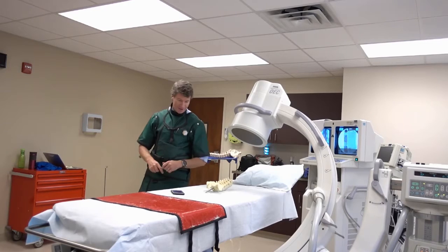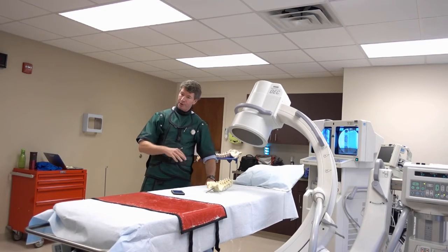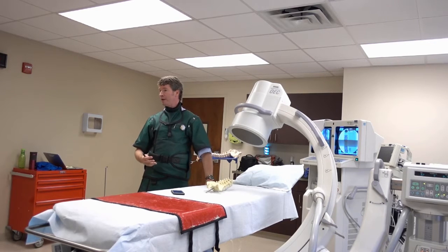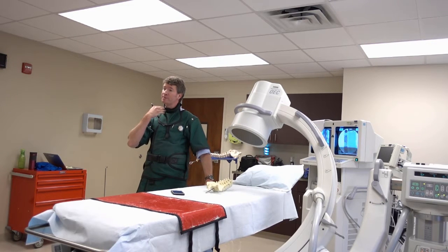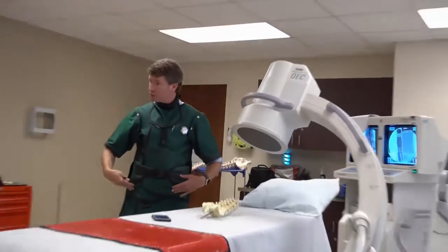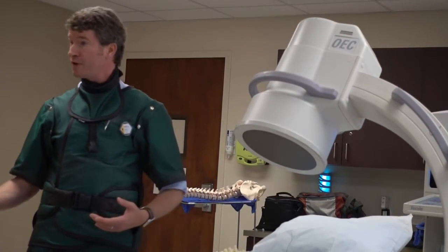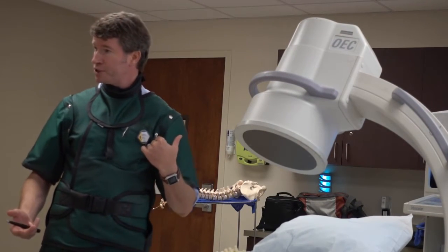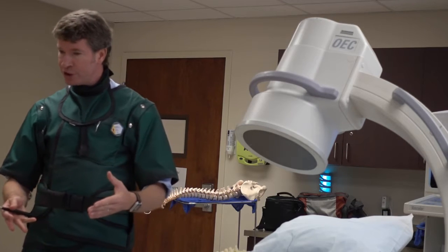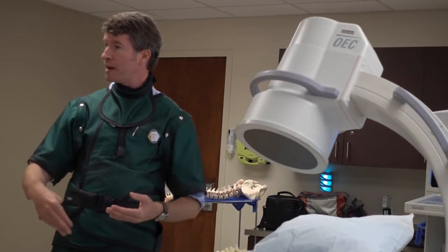Right. Okay. But most of the time when we're working on the spine, they're going to be prone. Occasionally, they will be supine when we want to get to the front of the spine in the neck for a stellate ganglion block, or maybe a hip injection we often do from the front. We can do a hip injection on both sides. A knee, for example, is often done in the supine position. Ankle and foot projections are easiest because we're coming usually through the top of the foot.